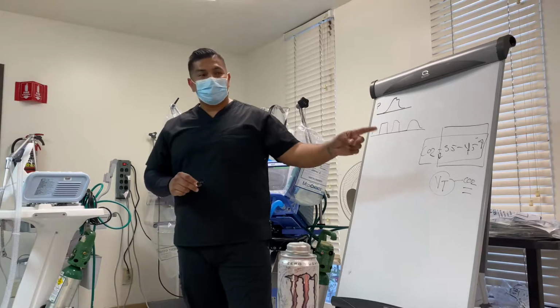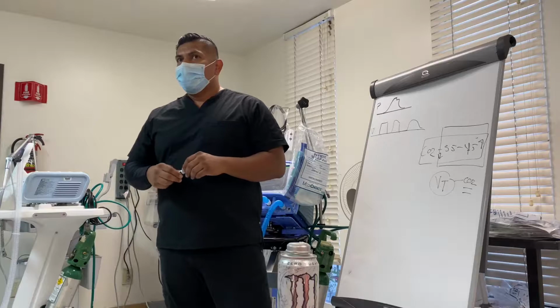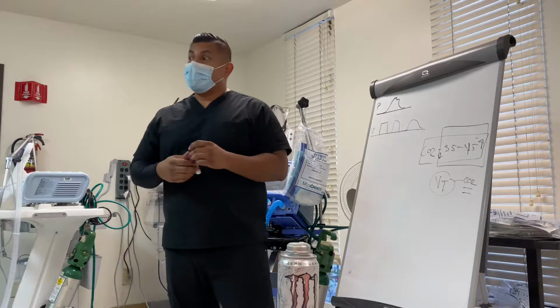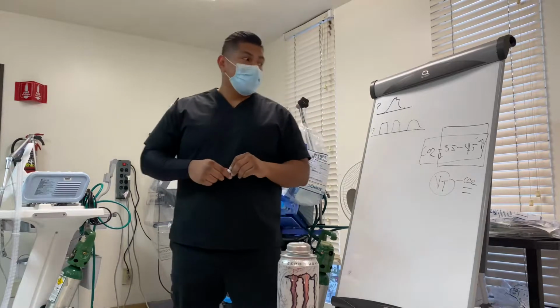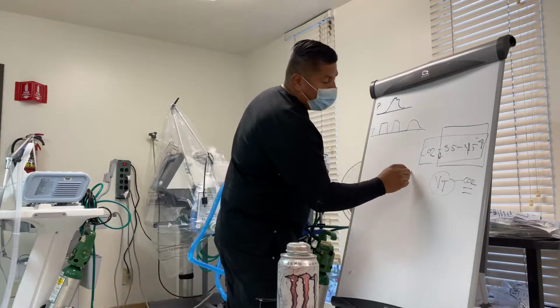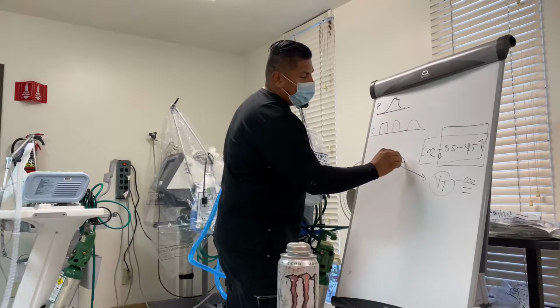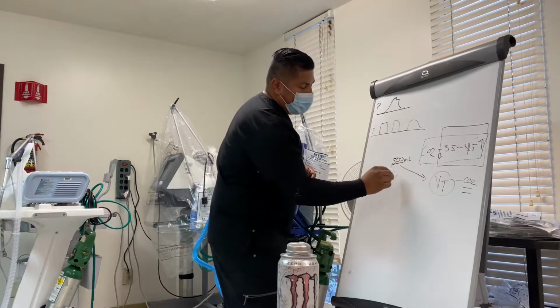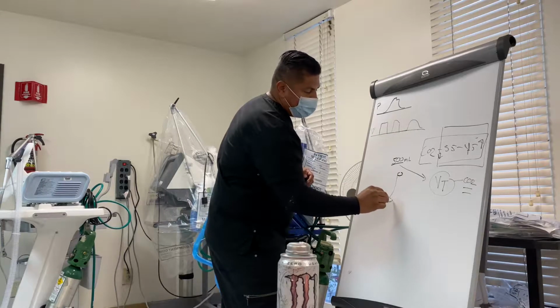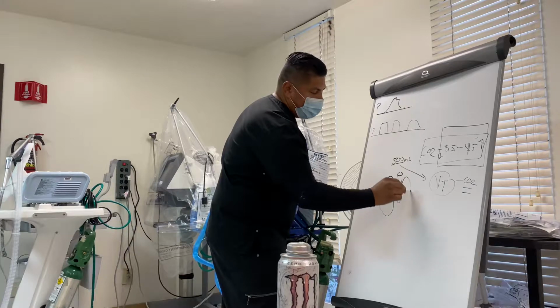Here's the problem: the modes that we have today are a little bit out of date. If we have a tidal volume that we control, for example, let's say that the doctor orders 500 mLs, and we have a lung, those are my lungs, I'm sorry.